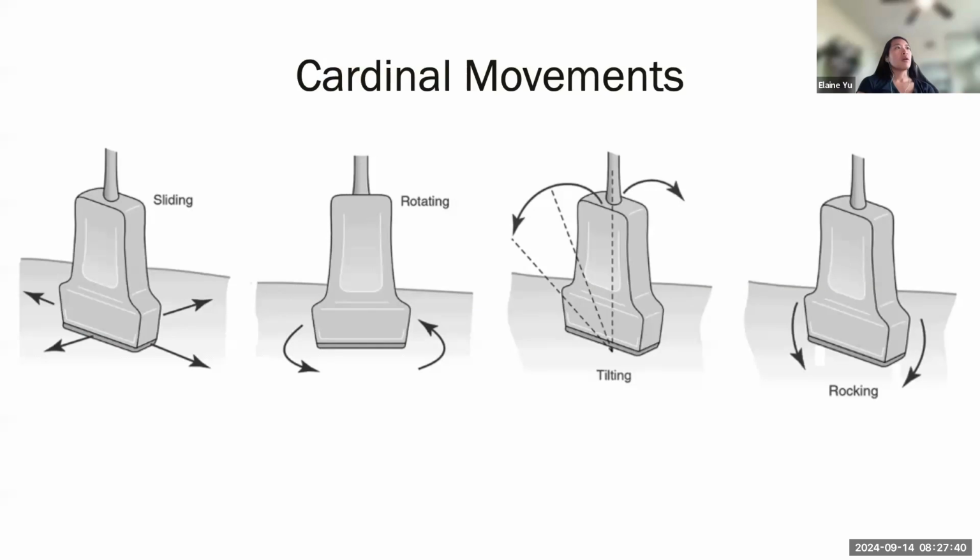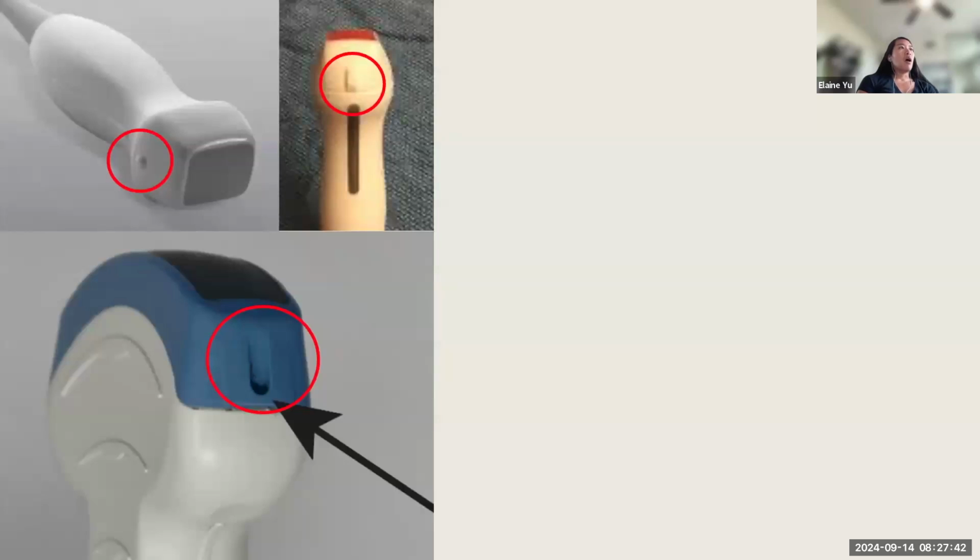Yes. All right. On each probe, there should be what's called a probe marker, and it can take various different forms and it can be tricky. Sometimes it's the classical dot, sometimes it's a raised sort of line or nick, and sometimes it's actually sunken.